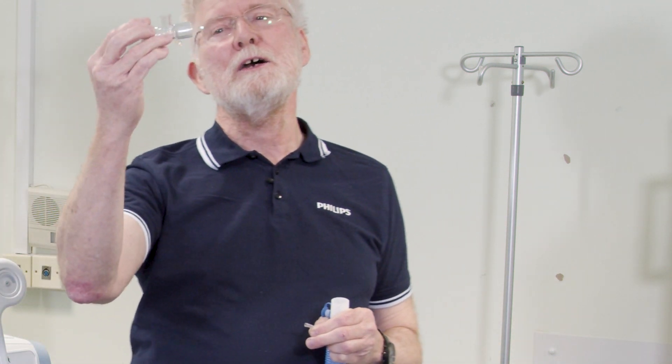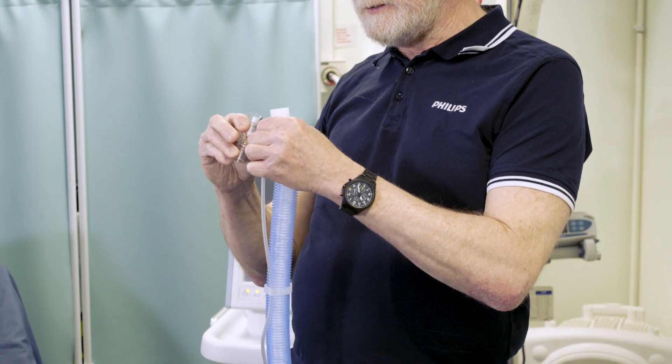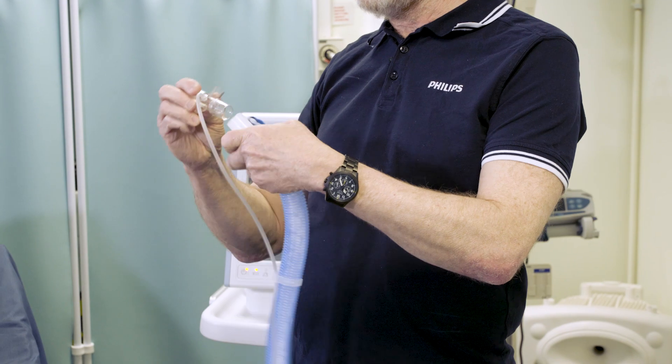So you take out the non-shrouded exhalation port and select a shrouded exhalation port. You'll put your proximal pressure line on the side and place it in the circuit.